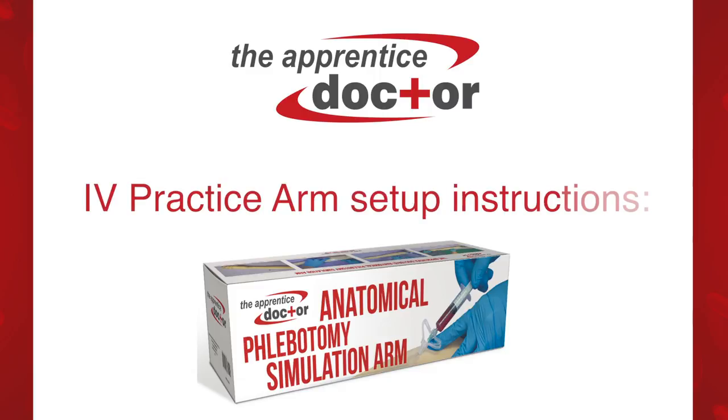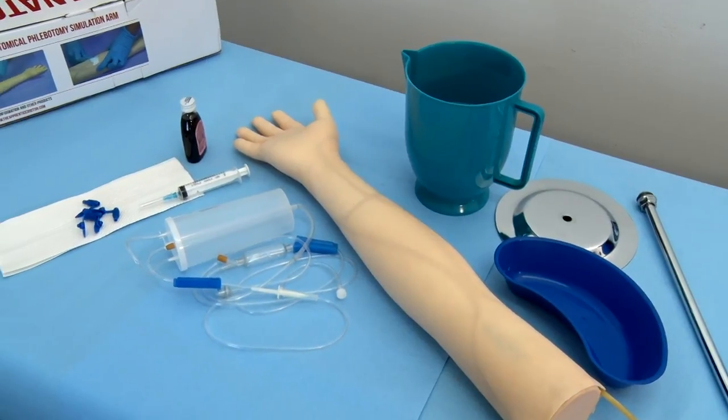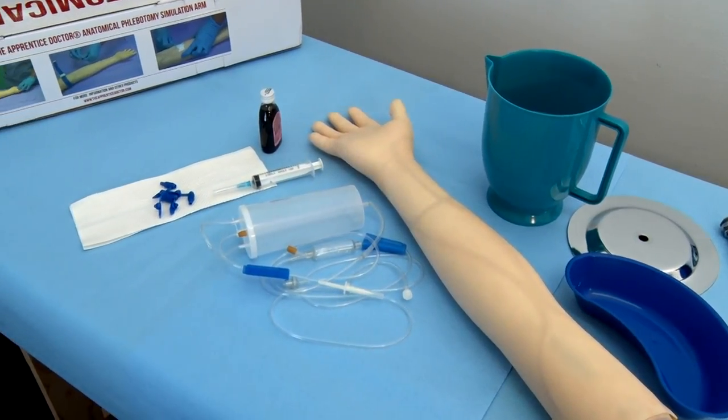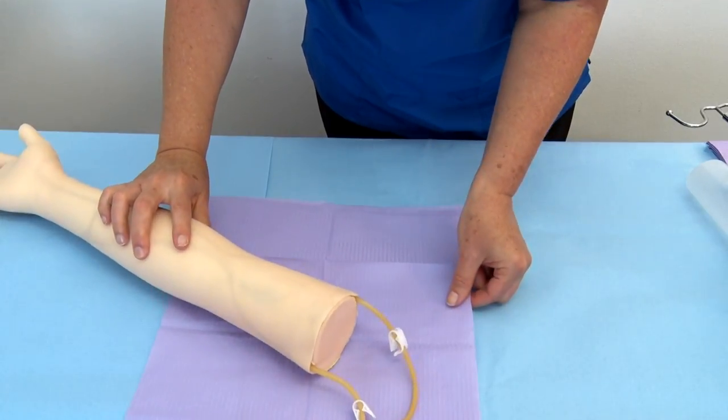IV Practice Arm Setup Instructions. Step 1: Remove the plastic covers from the arm and other items and gather them on a work surface. Step 2: Place a protective cover or paper towels on the work surface.